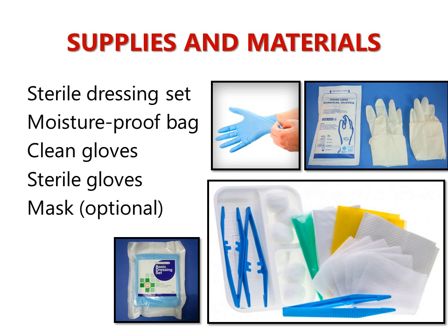What else? You need to have two types of gloves here. You need to prepare clean gloves because you need to use those when removing the old dressing of the patient. And you need to prepare another pair, sterile gloves, which you're going to use in the actual performance of the wound dressing. If necessary, you can also use a mask, but that is optional.